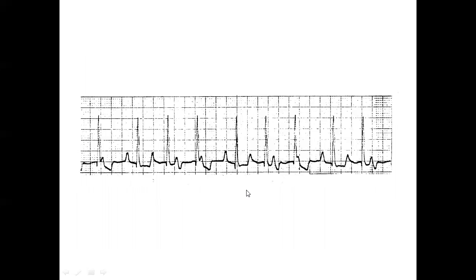Looks a little bit complicated, but at a quick glance, you might say, oh, there are P's and QRS's not paying attention to each other, complete AV block. Right away, it's not the case. Complete AV block, the escape mechanism is very regular, especially if it is a junction escaping. Junctional rhythm is the most regular rhythm of all, so the QRS is not occurring regularly, right away will rule out complete AV block. So you have to make some connection one way or another.